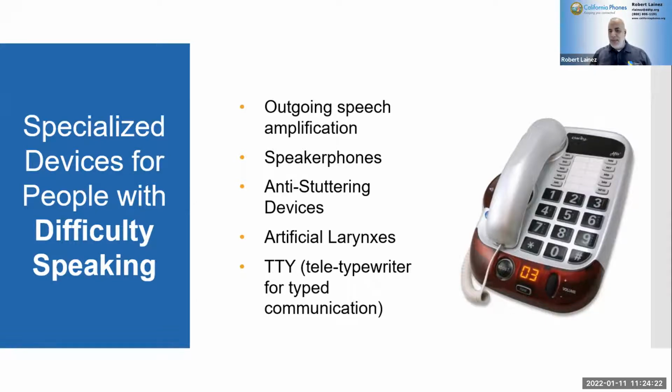For example, I have one of the devices here. It's probably kind of hard to see, but there it is. I'm actually going to give you a demo. The reason I'm giving you a demo is just to show you how the program works for us. This has nothing to do with a telephone whatsoever, but it does give a person that may not have a voice box or a larynx anymore the ability to communicate with the phone. So I'm just going to give it a shot here. Hopefully you can hear me.